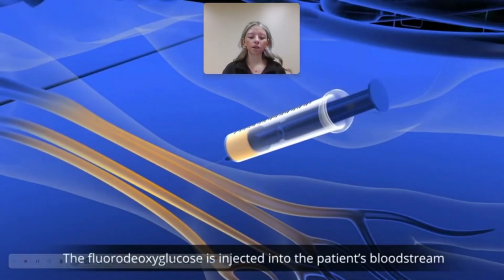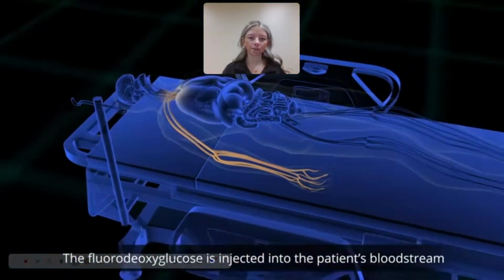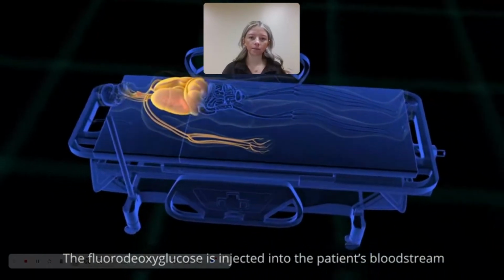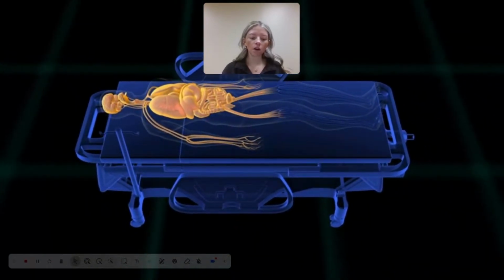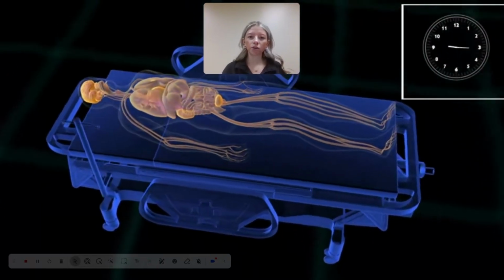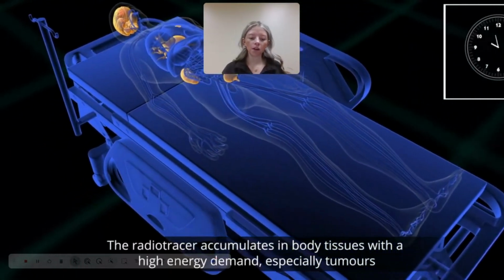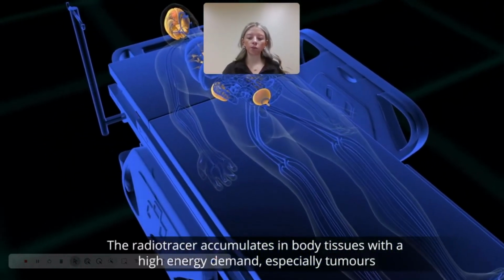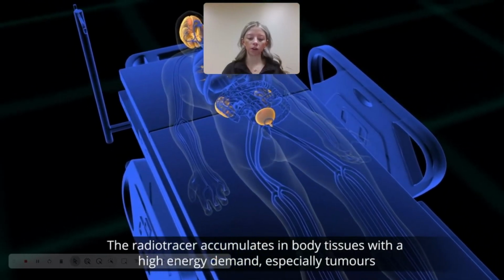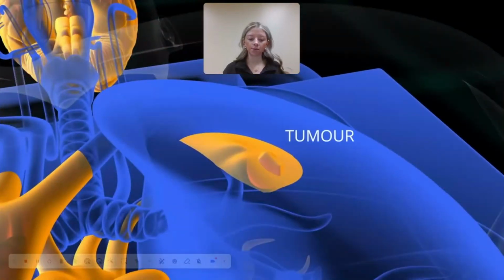Here we'll notice the glucose material is being injected into the bloodstream. Once the material is injected, the patient will be in the waiting period. This period usually takes about an hour. During this period, the glucose accumulates where the cancer or tumor cells are. This is because they are hungry to keep making the bad cells.